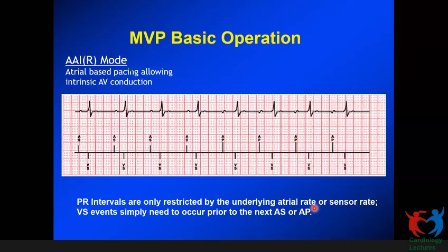And then the other mode that is available now is the MVP mode, which is managed ventricular pacing. Based on the current clinical evidence and the current practice, you want to minimize ventricular pacing when the patient has AV conduction, although the patient may have slightly prolonged PR conduction times. So MVP eminently achieves that.